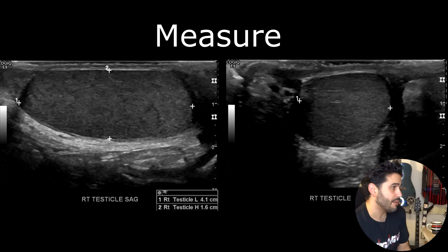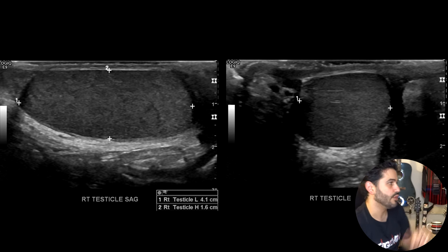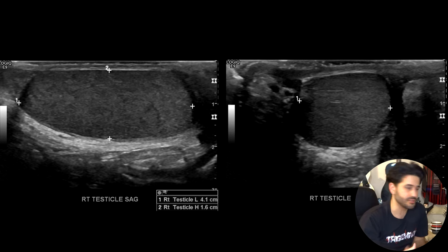Once you're done with the dopplers, you want to measure. In your sagittal and transverse images you measure from superior to inferior, anterior to posterior, and your transverse width. Here this testicle measures 4.1 by 1.6 by 2.1 centimeters with a volume of 7.2. I'll put a diagram in the finished video explaining normal testicular measurements by age.